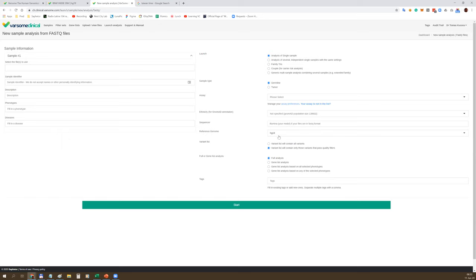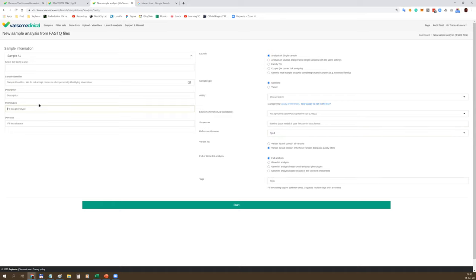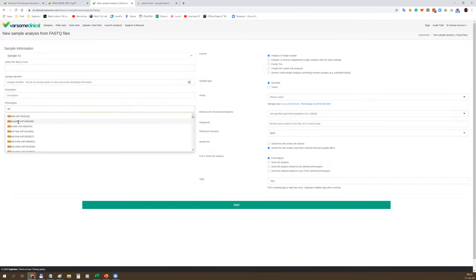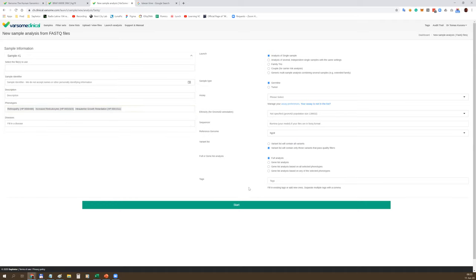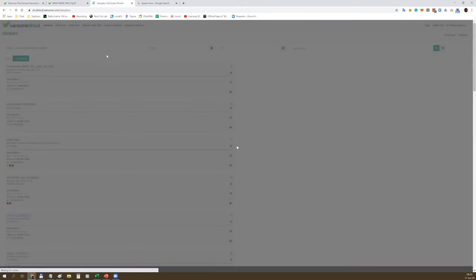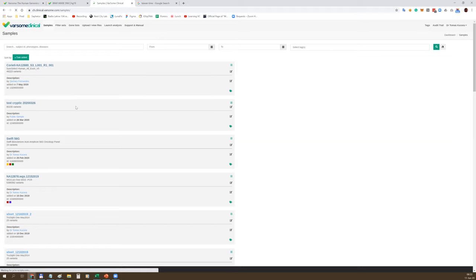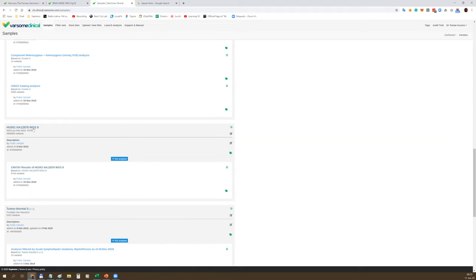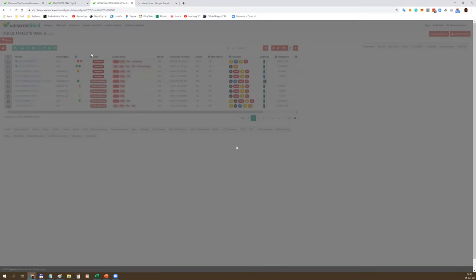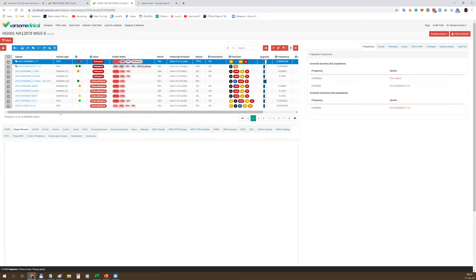Or it can be any other custom gene panel. If it's a custom gene panel, we need a BED file from you before you can start the analysis, but in principle we can process any kind of NGS data. Further, you should specify the reference genome, whether it's hg19 or 38. On the left side, you should specify the patient phenotypes and diseases in line with HPO terms - human phenotype ontology. For example, you can type in a retinopathy term in line with HPO, and later it allows you to prioritize variants based on these phenotypes.